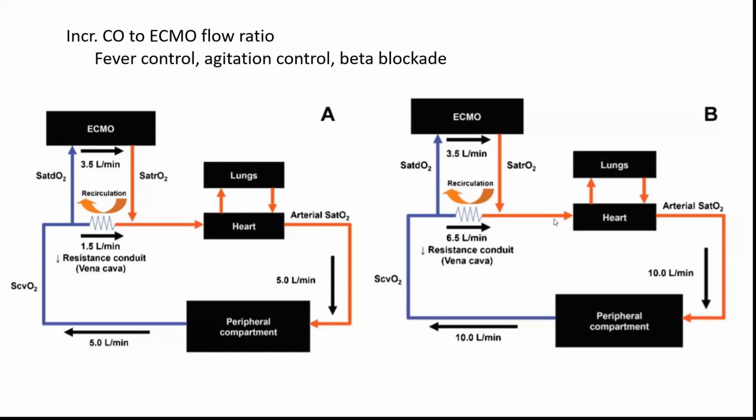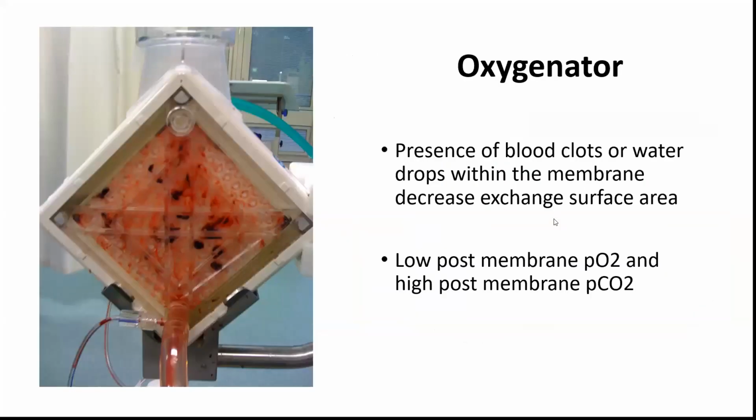Reflexively, if we're hypoxic, we go up on the flow. But again, understanding the etiology and treating that is going to be important. All right, oxygenator issues. That's what clots look like. Of course, that's going to lead to hypoxia in your patient.